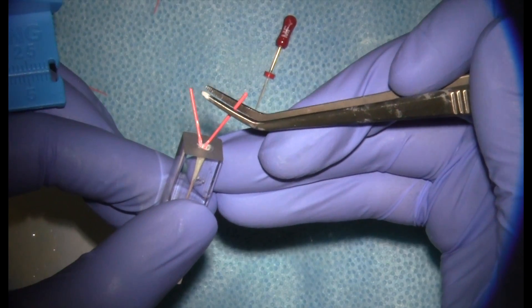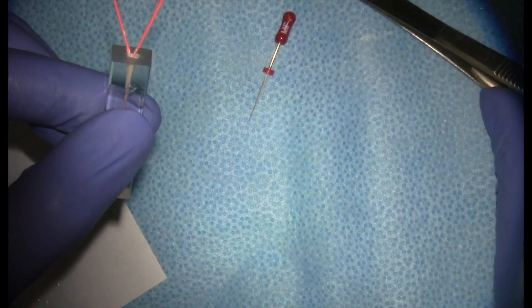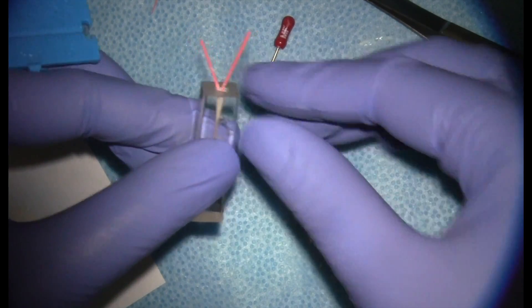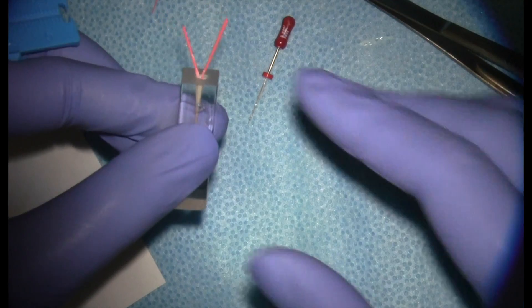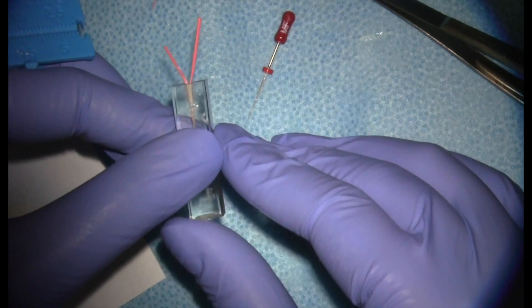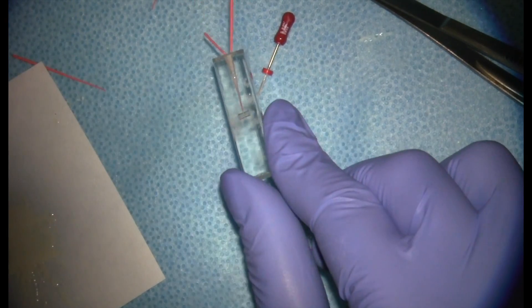If the accessory point doesn't go to length — if it stops short — you don't want to leave it in there. You'd take it out, put your spreader back in, measure another point, and ensure it goes to length. If you don't get your cones to the length your spreader went to, you're leaving spaces or potential voids within the canal space that aren't sealed.